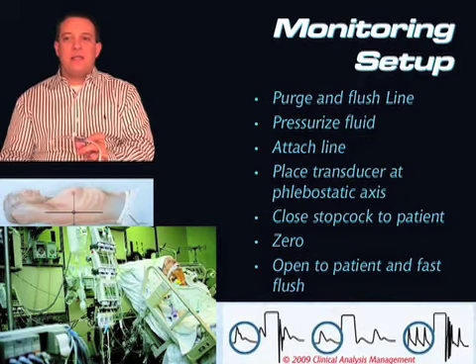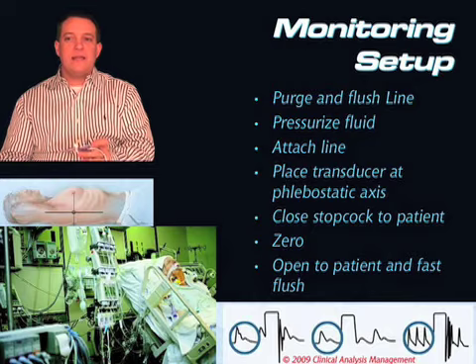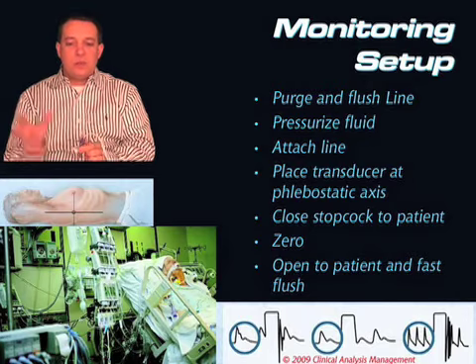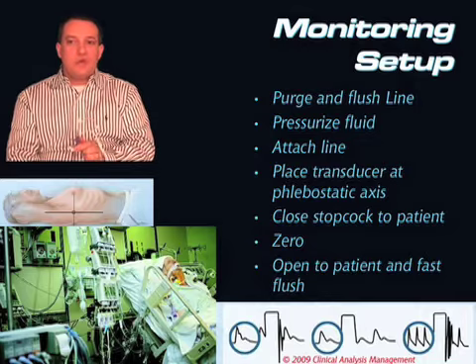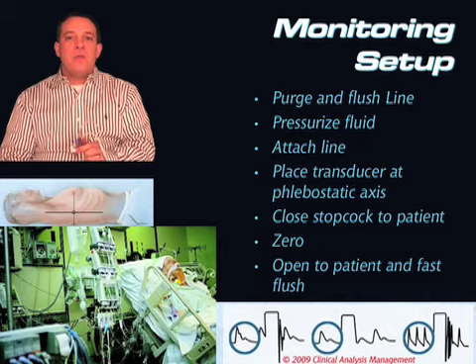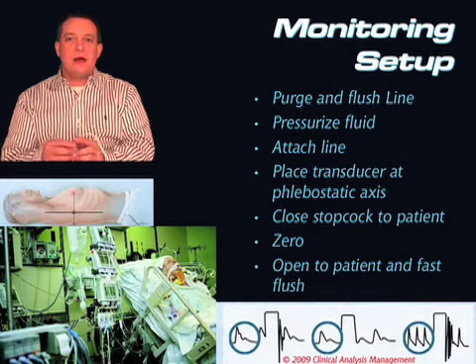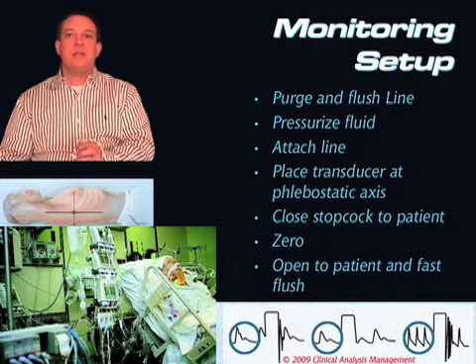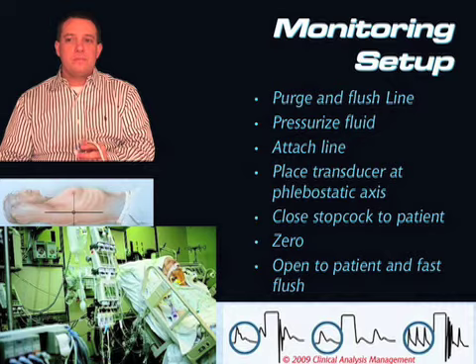Now let's look at the second group of waveforms. When we pull on the transducer and release it, there's an immediate drop and there's no bounces. It just goes right back into a waveform. That is called overdamping, and that tells us that the system is not dynamic enough. That means the system is too stiff. It's not bouncing and moving like it should, so that's a problem.